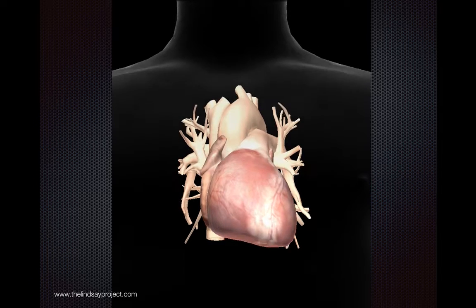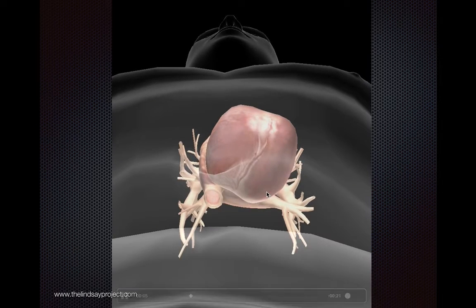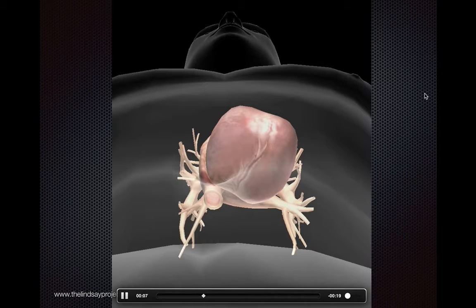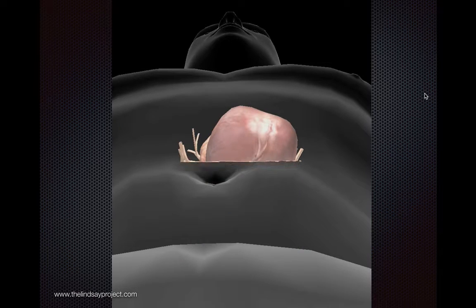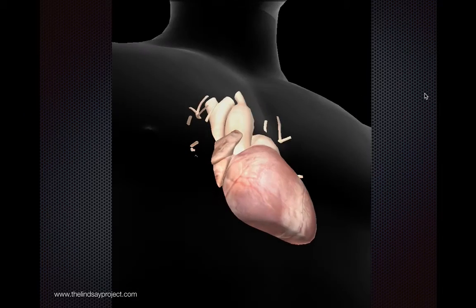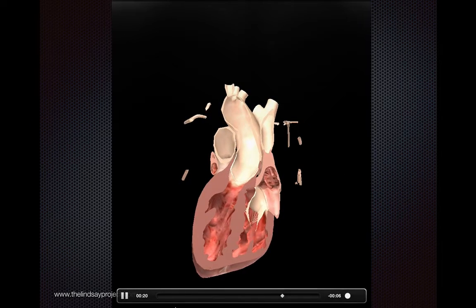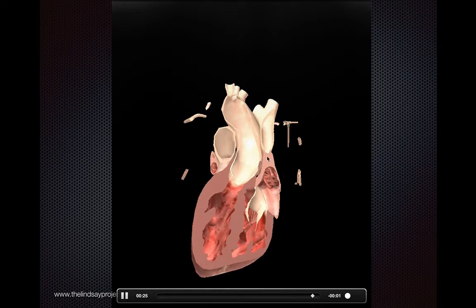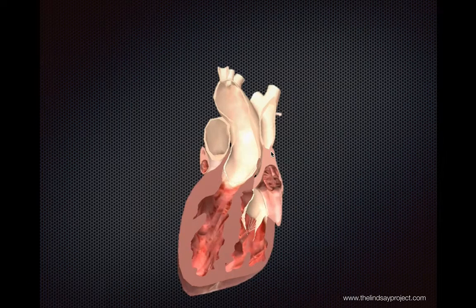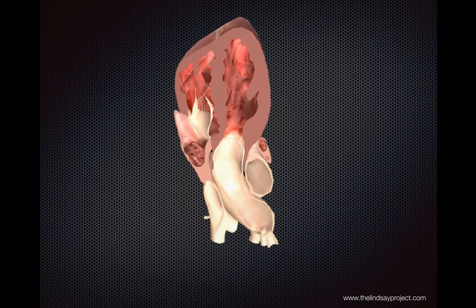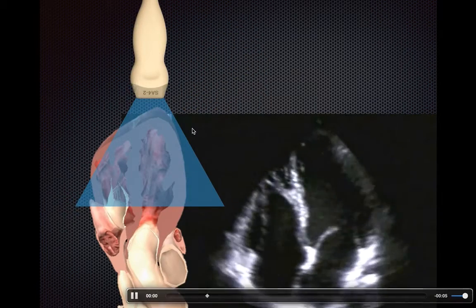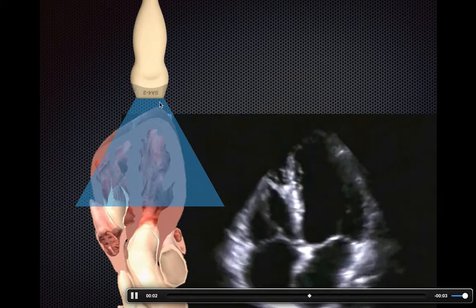What you're doing is looking directly at the apex and trying to obtain a coronal cut through the heart through all four chambers. Flipping the orientation around, you have your transducer right at the apex, pointing into the heart — essentially looking straight at the apex from below.